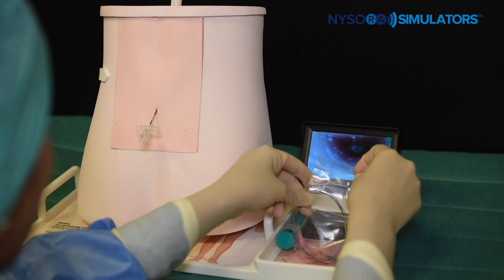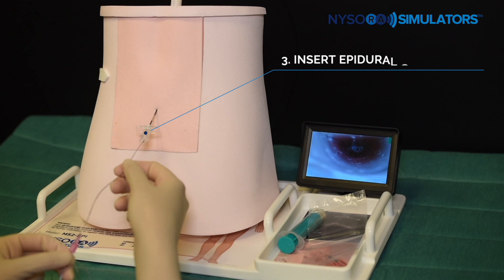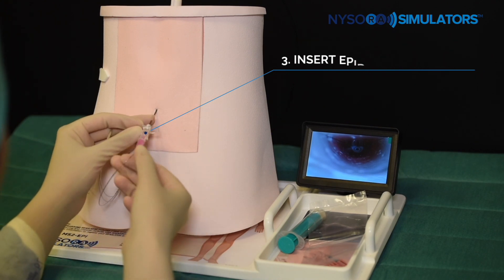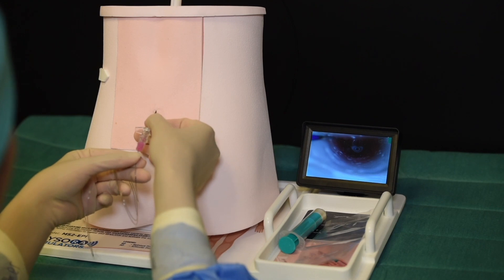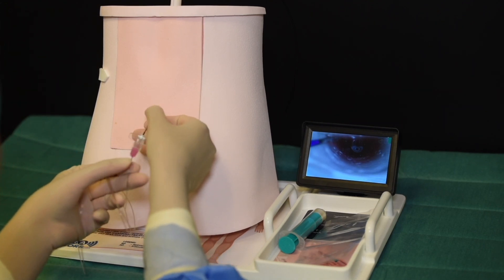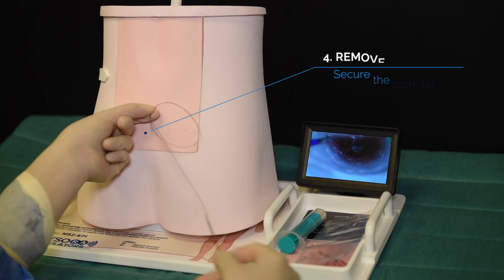A catheter is then inserted through the needle and passed into the epidural space. This can also be confirmed using the camera and the optional screen, where the catheter is seen entering the epidural space. The needle is then removed and the catheter is secured. This allows the practice of epidural analgesia on a simulator before approaching the procedure in patients, which could result in complications such as post-dural puncture headaches.